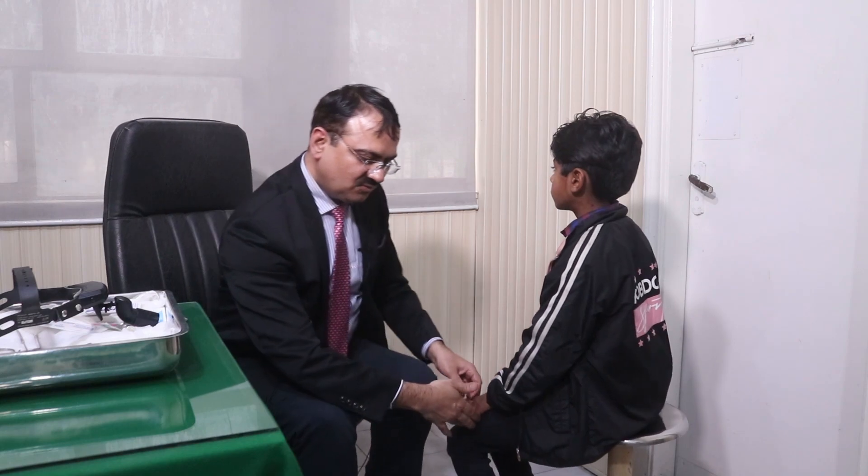The tests performed are: Weber, Rinne, and ABC — equal to the examiner. In this way, we will now test the voice test. In the voice test, you have to position the patient correctly, at one arm's length.